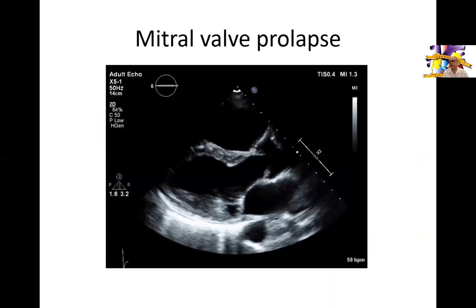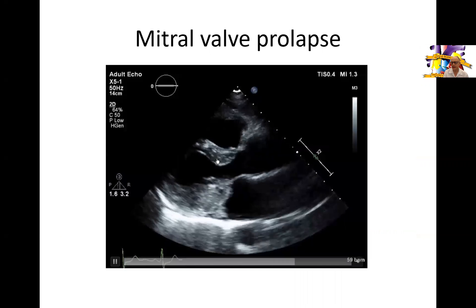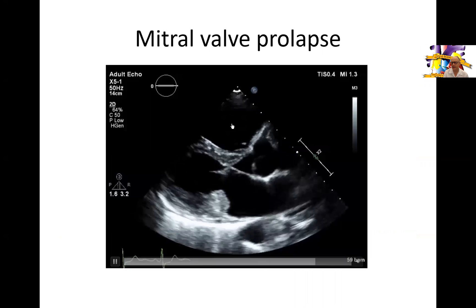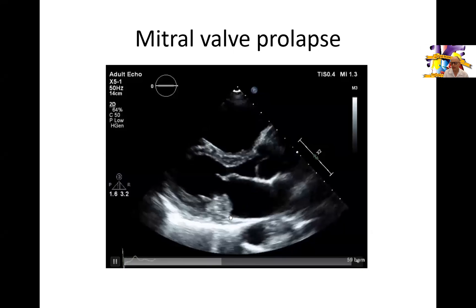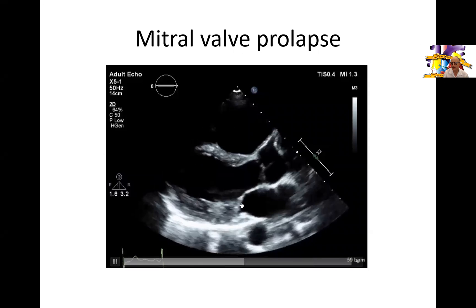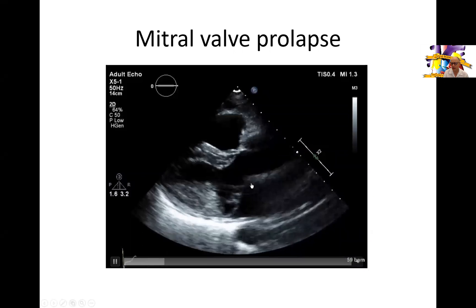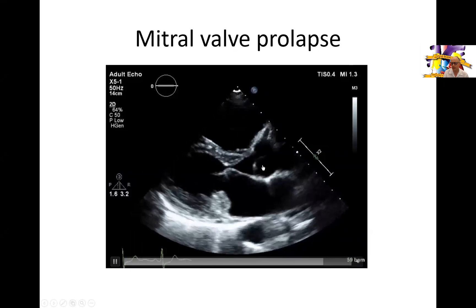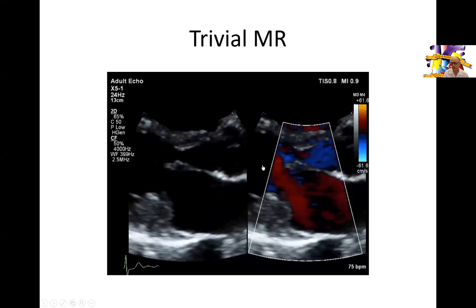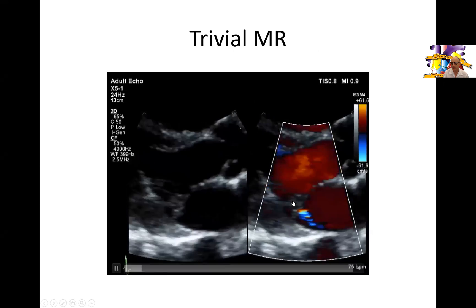This is the first echo view we're going to discuss today. What you can see is a significantly dilated right side of the heart. This is a parasternal long axis view with some evidence of mitral valve prolapse, where you can see the mitral valve — probably more posterior than anterior leaflet — crossing that imaginary line at the mitral annulus. Otherwise the ejection fraction is normal and the aortic valve appears unremarkable. She also has some trivial mitral regurgitation, as you can see right here.